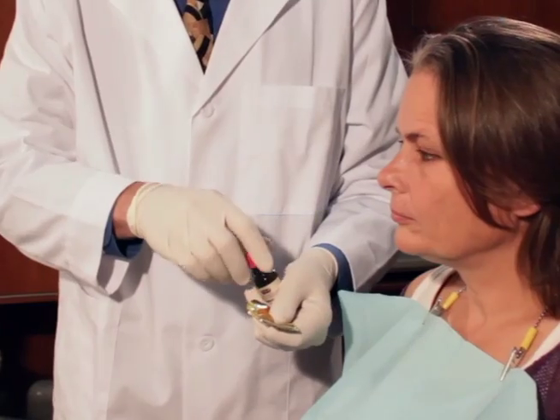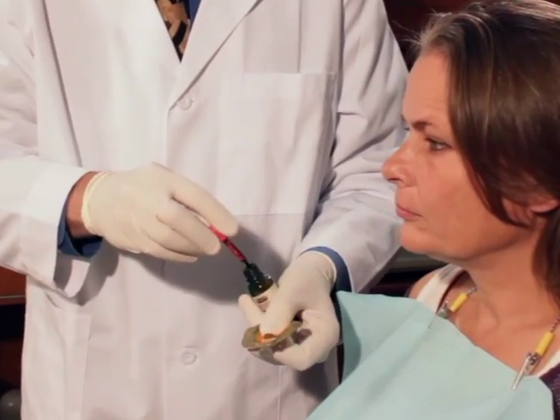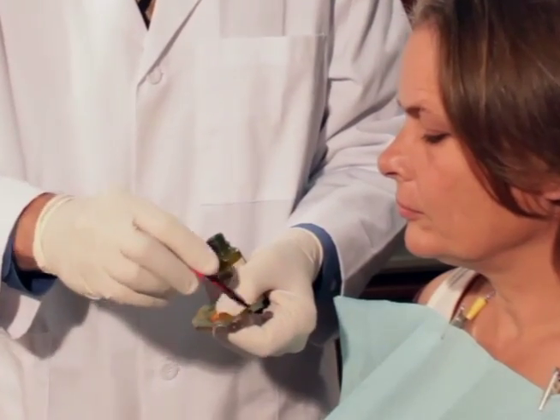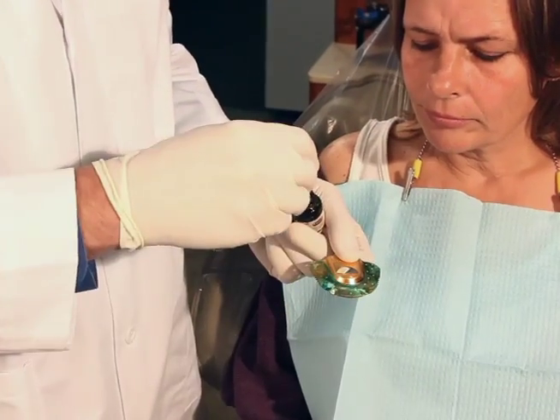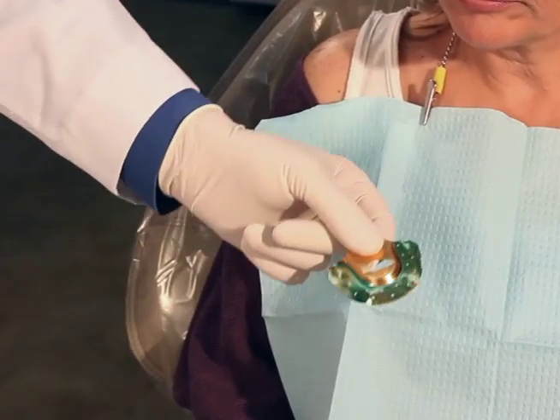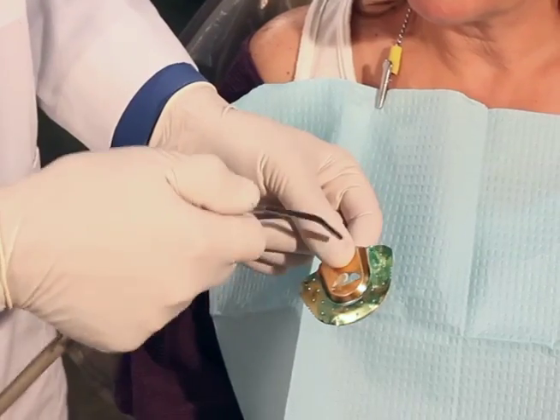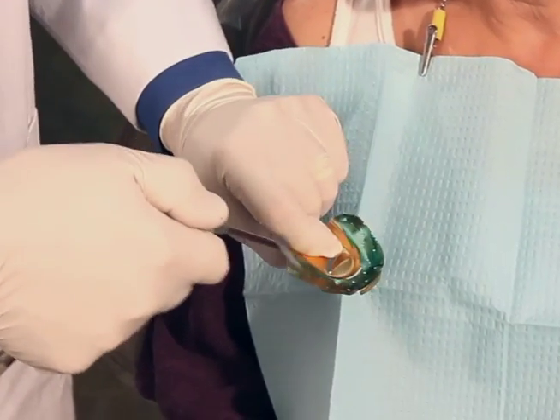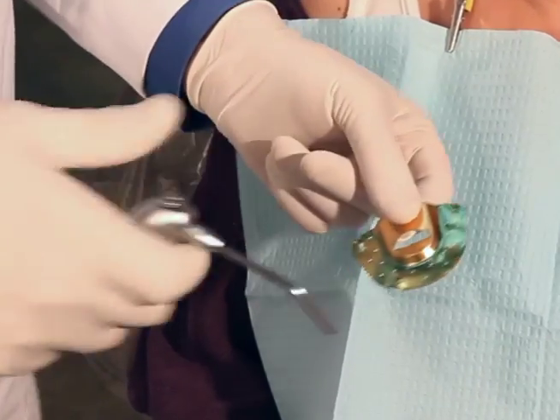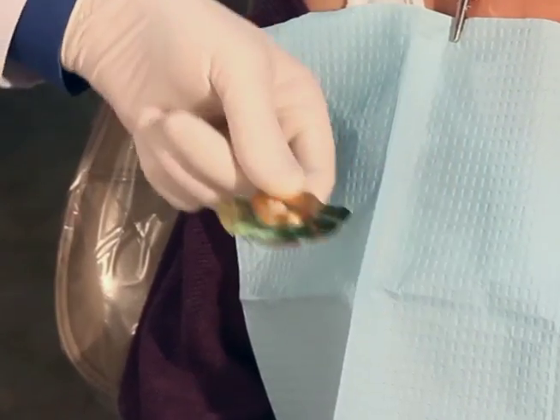Now we can actually use an adhesive on the tray. This will help the bite registration materials stick well to the tray. So we have a nice coat of adhesive on both the upper and lower occlusal surfaces. We can actually air dry that a little bit. Then we can go into the patient.